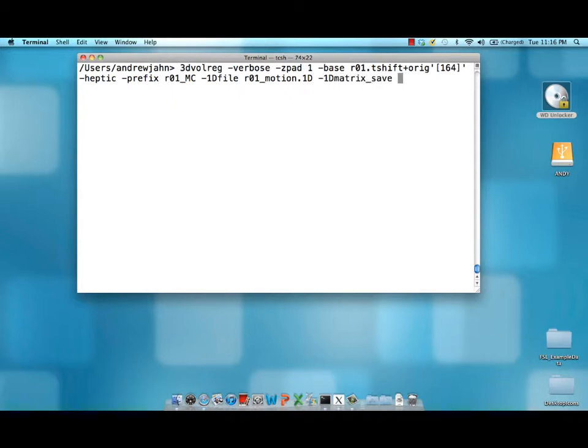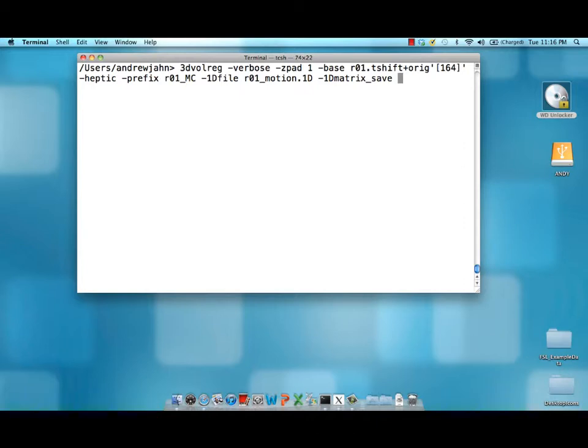Another useful option is this 1D matrix save. This is going to dump all the matrix transformation information into a text file. This is the matrix warp that was used to align each volume to the base in DICOM space.